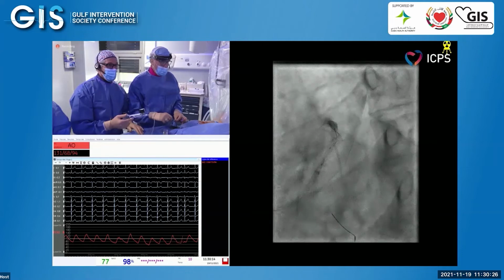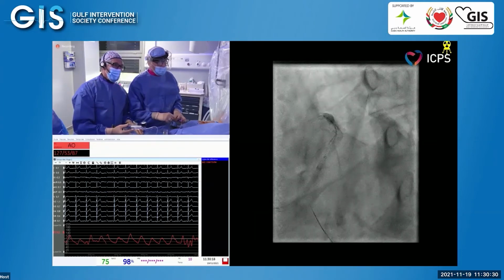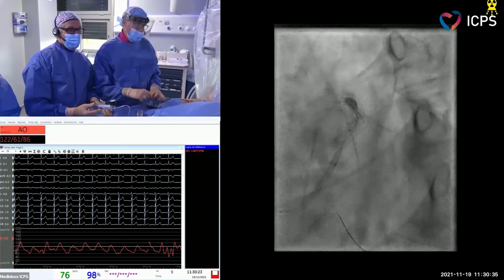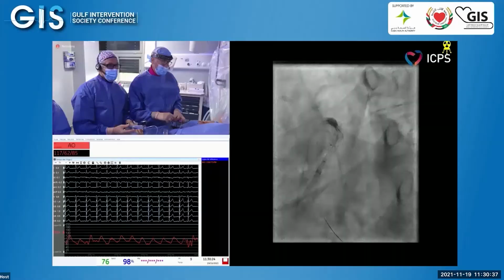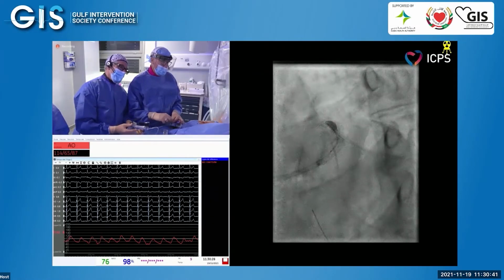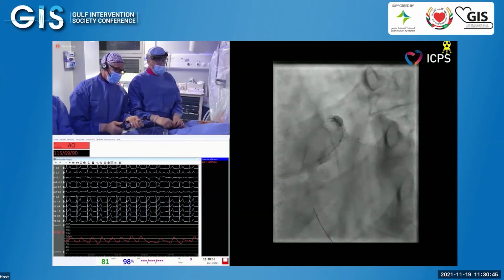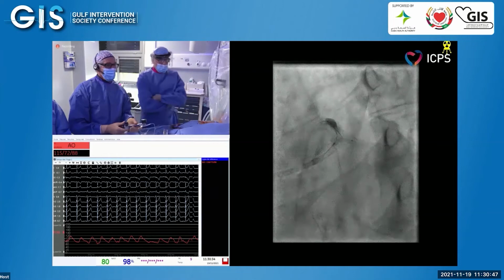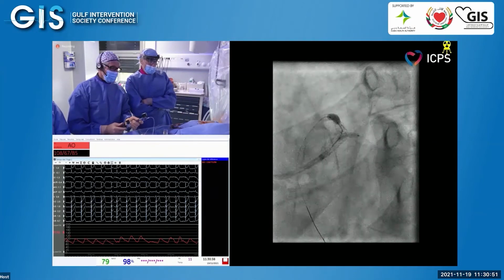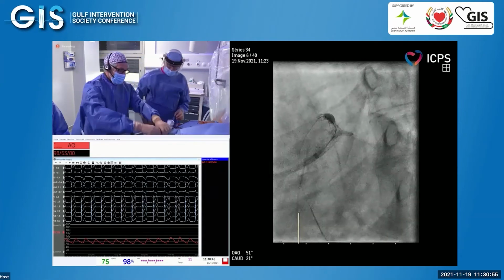So it's a kind of elegant way when you look at it, because the circ remains the Achilles heel of this distal bifurcation of the left main, to know, because the bailout happens, in the Excel study, it was 22%, and in the DK crush, it was about 47%. So it's something which we might look into as a routine practice, so that you don't do provisional when you have those criteria, because you will know mostly you will end up with 2 stenting. Thank you very much. Thank you.